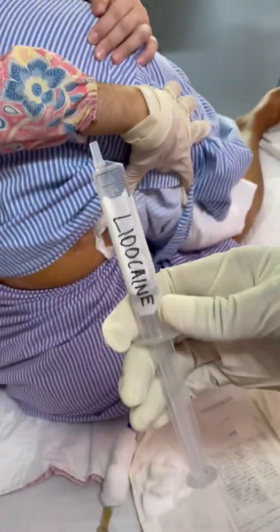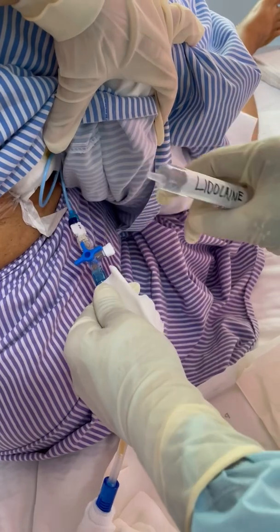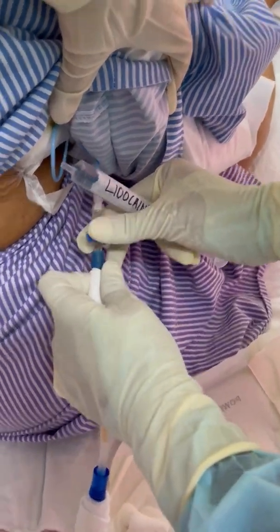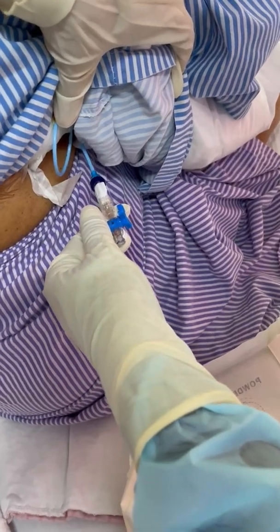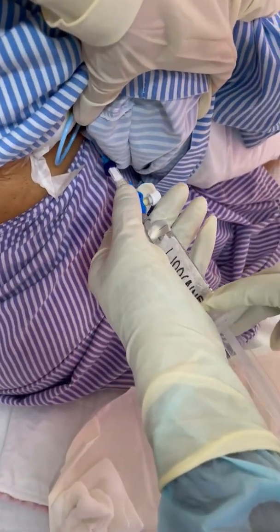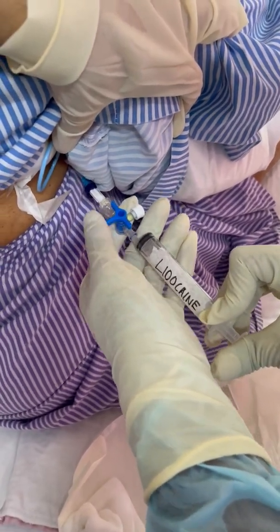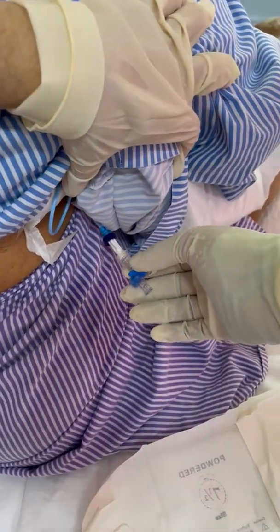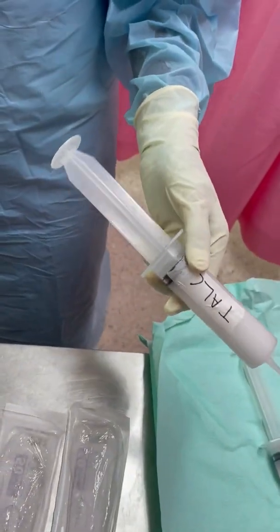First, we will prime the patient with the lidocaine. Make sure the three-way bung is closed towards the patient prior to removal. You can ask the assistant to hold like this. Connect our lidocaine, open towards the patient, and prime the patient with the lidocaine. Then make sure it is closed. Just wait for 1 or 2 minutes.